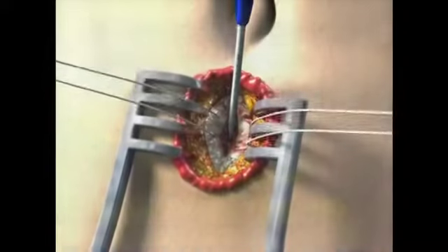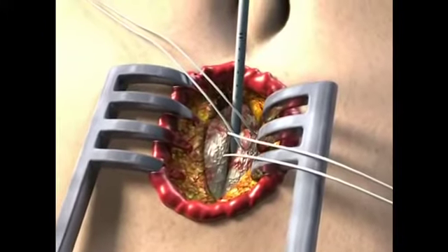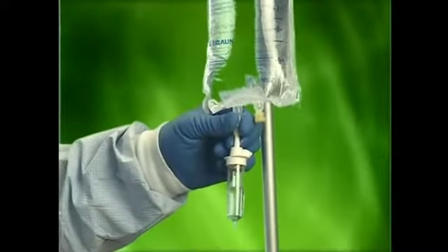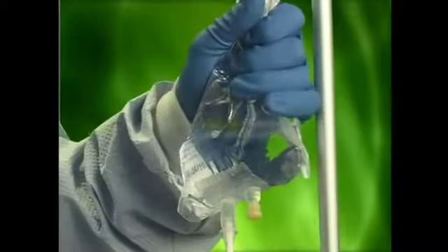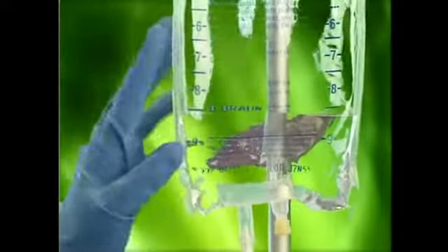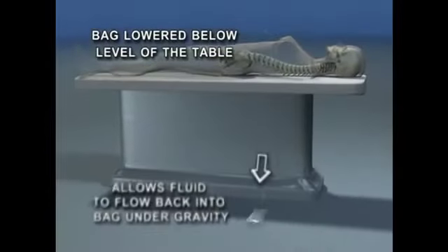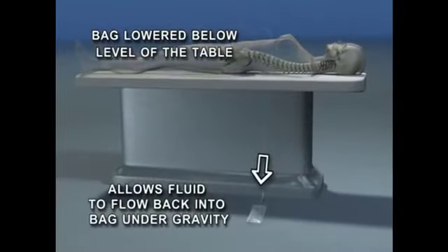The two stay sutures are then crossed to create a tight seal. A liter of normal saline is then allowed to flow into the abdomen under gravity — it should not be forced in under pressure. The entire bag is not allowed to empty, but a very small amount is left in the bag and the bag is lowered below the level of the table to allow the fluid to flow back into the bag under gravity.